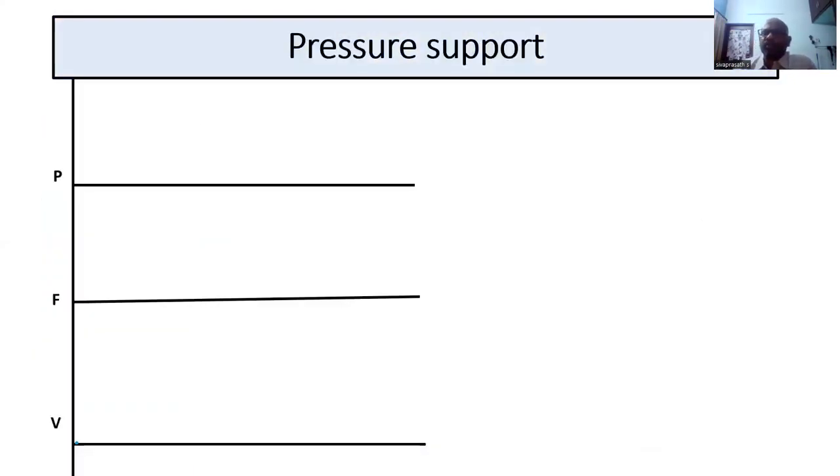Coming to pressure support modes now, the control modes are over. The intermittent mandatory modes are over. Coming to spontaneous pressure support modes where you have the maximum number of advanced modes. So a pressure support is for the first, here, a spontaneous breath.